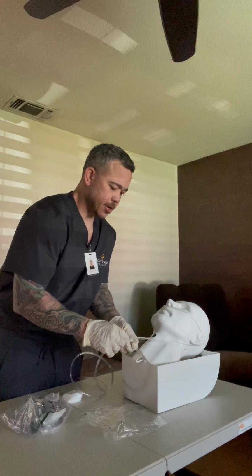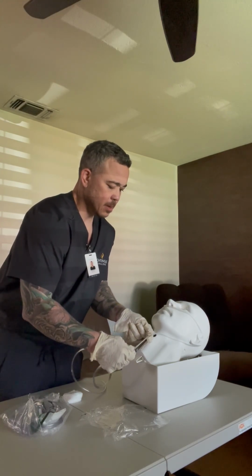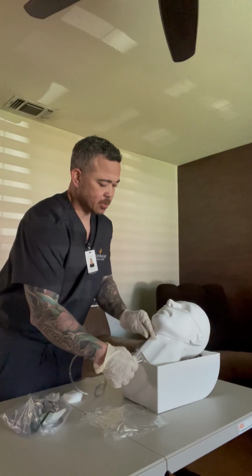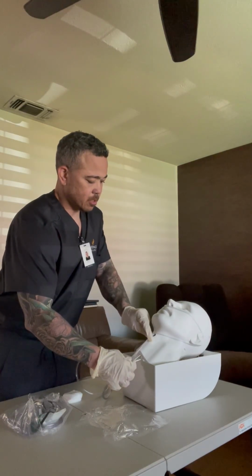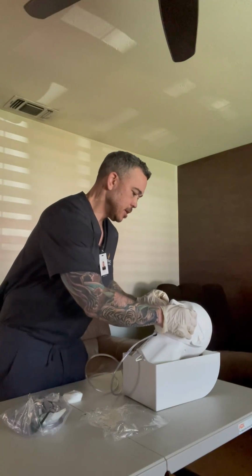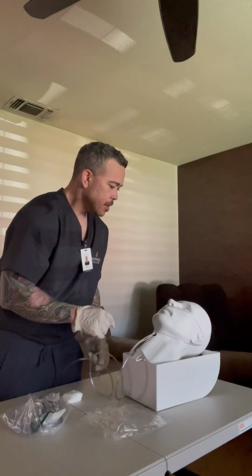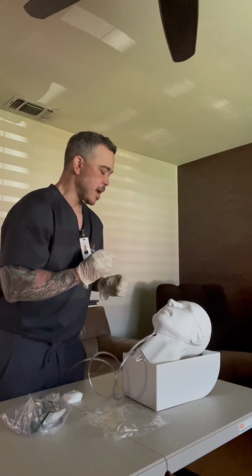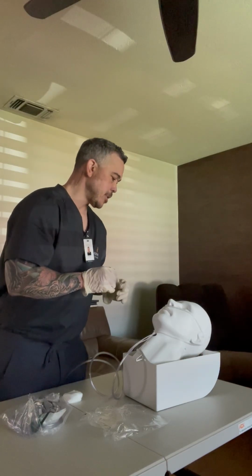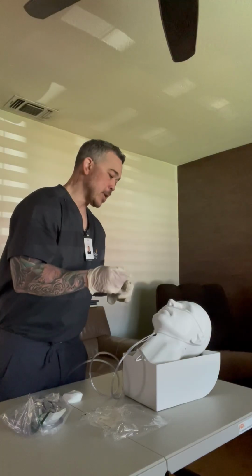And then this portion down here has a little slide that comes up so we can secure it against the patient's chin here so it doesn't fall where it's unstable. Okay. All right. Got this adjusted. Comfortable? Perfect. Okay. The next thing I'm going to do is make sure I check every 4 hours for skin deterioration. Make sure that there's no redness or irritation or breakdown.